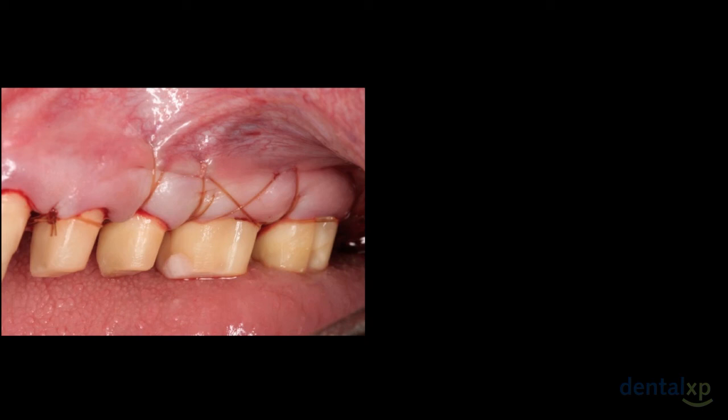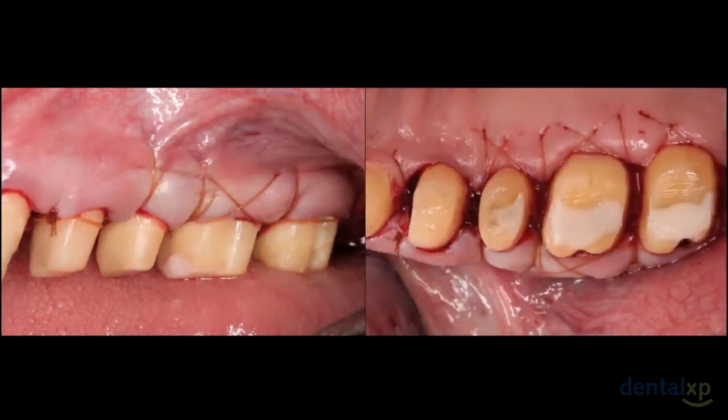As I said, I don't want any bone exposed other than a minor amount interproximally, which you can't help but avoid. In looking at this case, again, from an occlusal view, the flaps come in, and then there is a space interproximally which you cannot avoid, but you want to make sure that preservation of your papillas is crucial, and that therefore the healing will be much greater in terms of much less discomfort for the patient and much quicker healing because of primary closure.